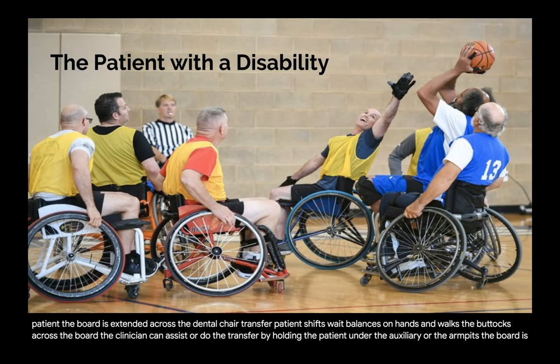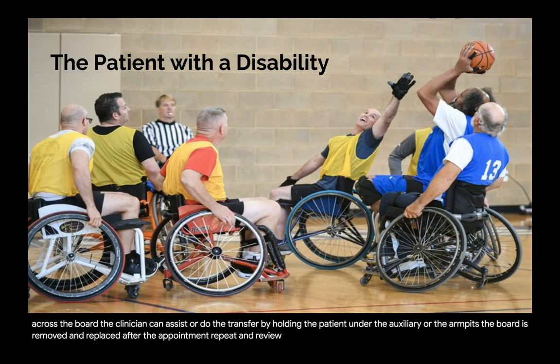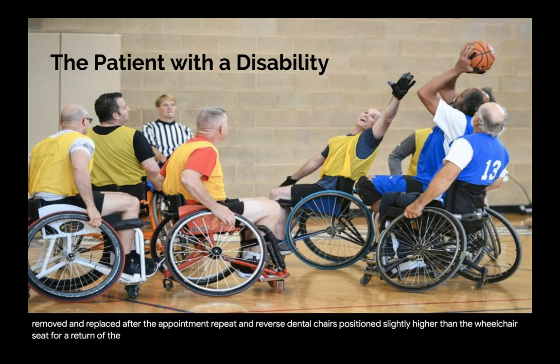The board is removed and replaced after the appointment. Repeat in reverse. The dental chair is positioned slightly higher than the wheelchair seat for a return of the transfer.